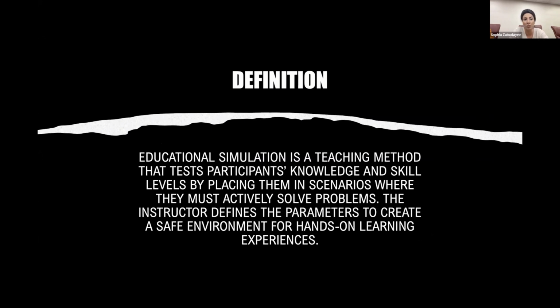So there's many things that we do in emergency medicine that you don't want to do for the first time on a patient. For example, if you're doing a resuscitative hysterotomy, otherwise known as a perimortem C-section, you have a couple minutes to perform that after the patient gets to the ER. And so you don't want to be thinking, what equipment do I need? What direction do I cut? You want to have some kind of muscle memory built in after having practiced this before, so you know what you're doing and feel a little bit more comfortable.